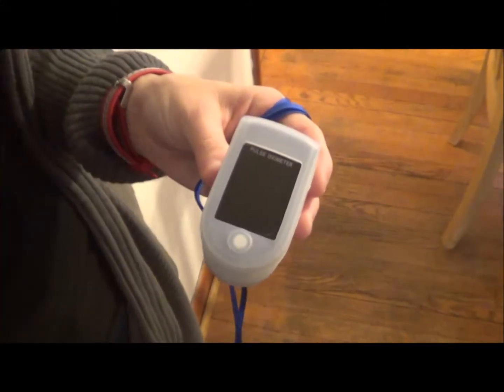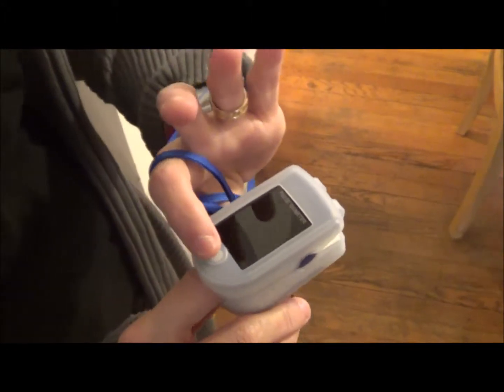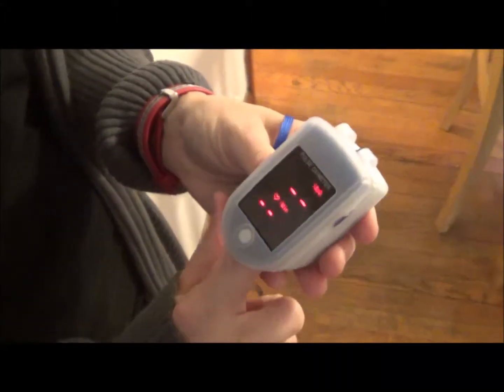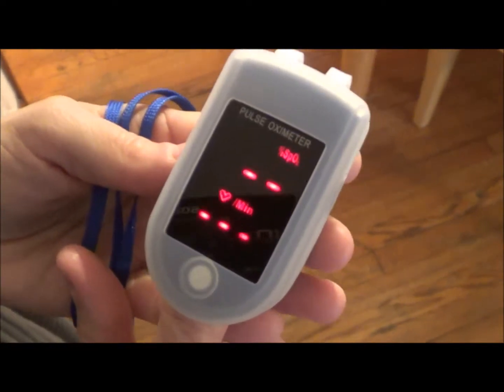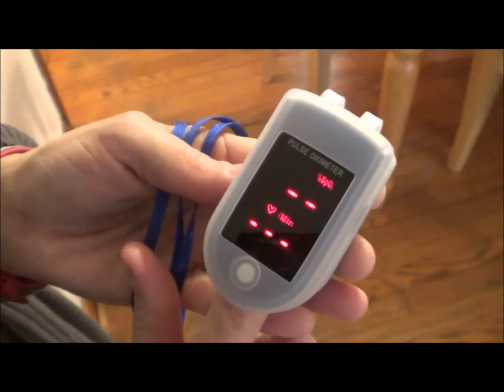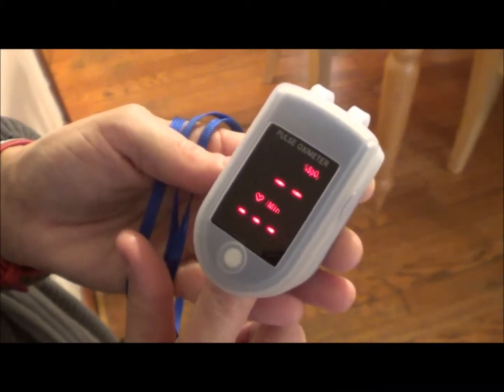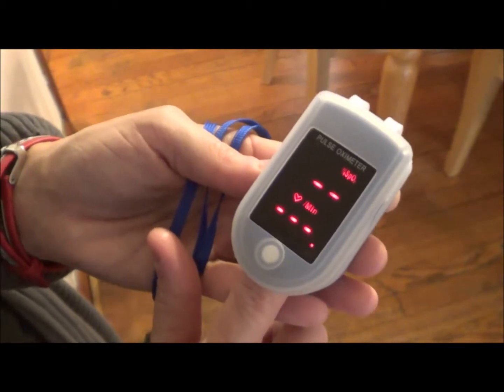It's really easy to use. You basically just take a clean finger, stick it inside, and press the power button. You'll know it's working when the bar on the right-hand side starts going up and down. It takes multiple readings before it displays the results, which generally take about four to six seconds to come up.